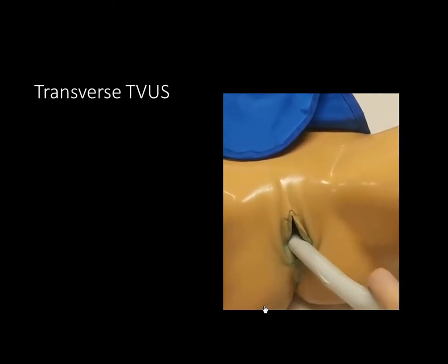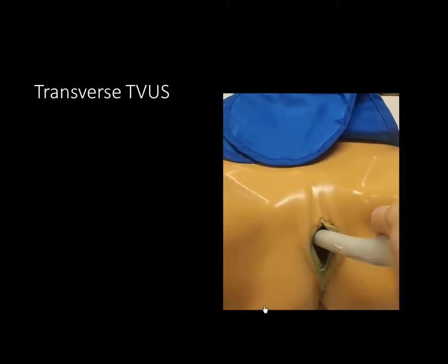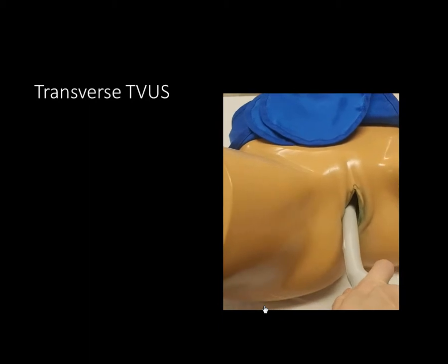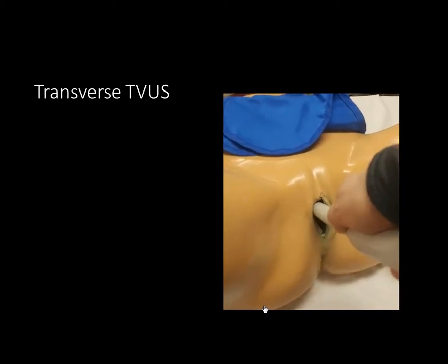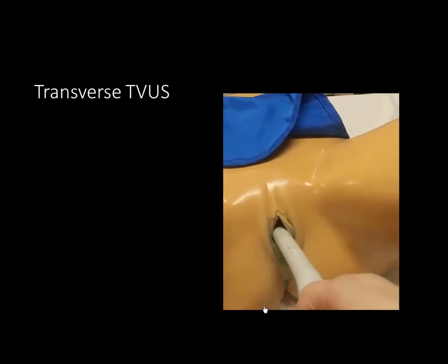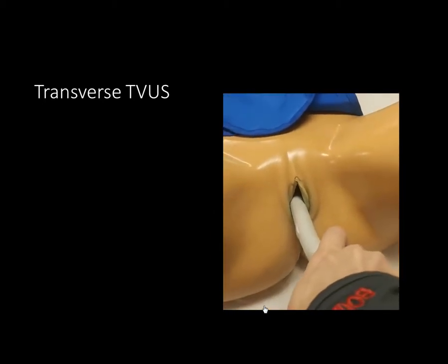While the scope of the scan is to identify an IUP and investigate for fetal viability, if free fluid is seen or an adnexal mass is seen, this should prompt further workup.